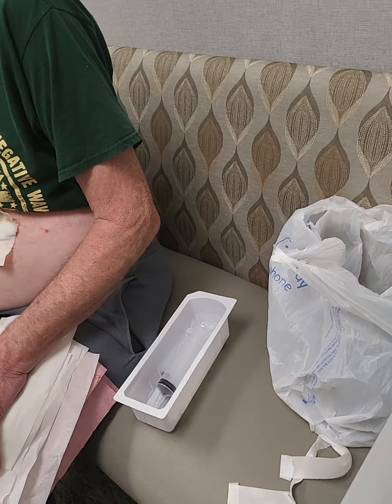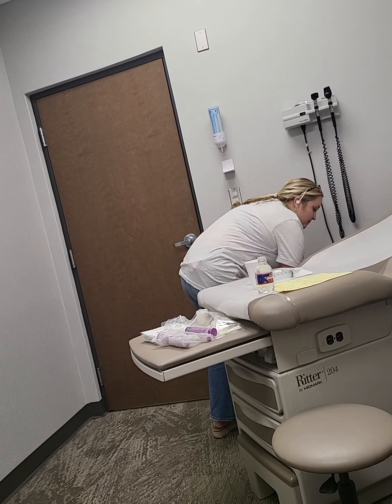All tubes will eventually be converted to this Enfit connection instead of the one that you just poke in. They have this little cap on here — you don't need the cap, so I'll take it off.